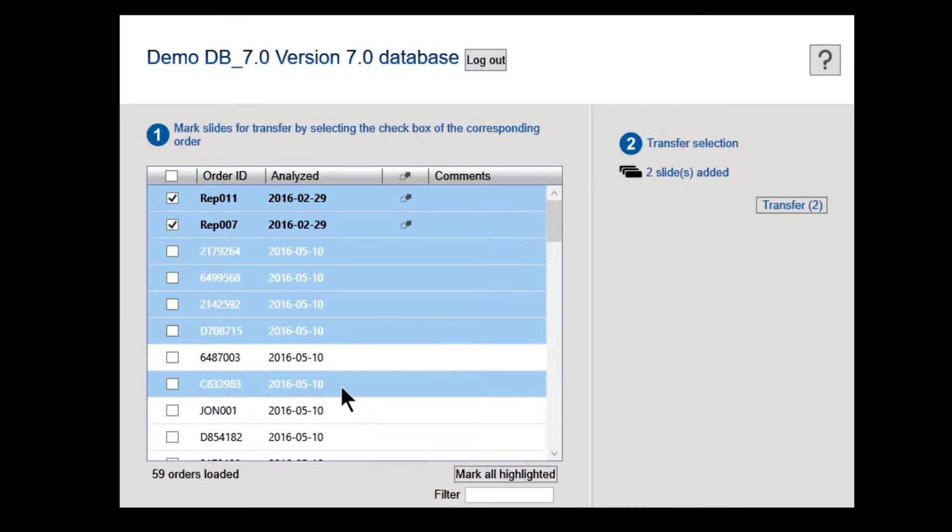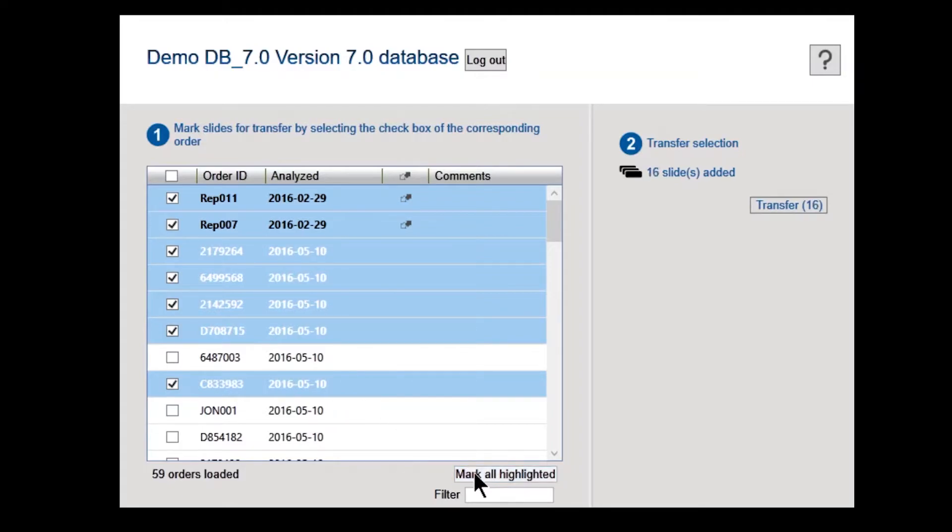After selecting all the slides you want to transfer, click Mark all highlighted. In the Transfer selection panel to the right, you can see the total number of slides marked for transfer.